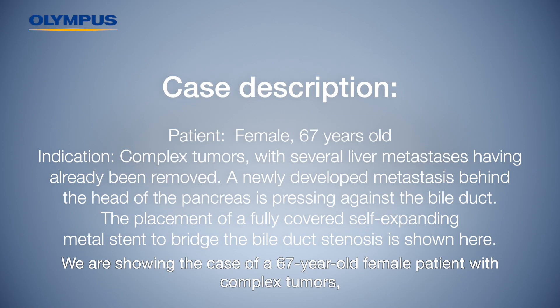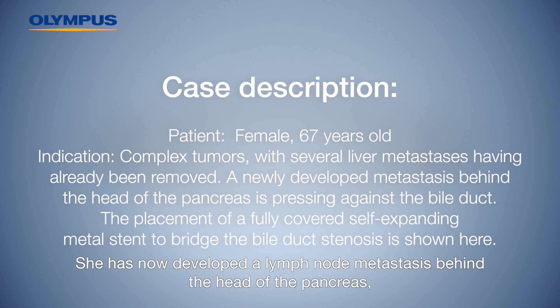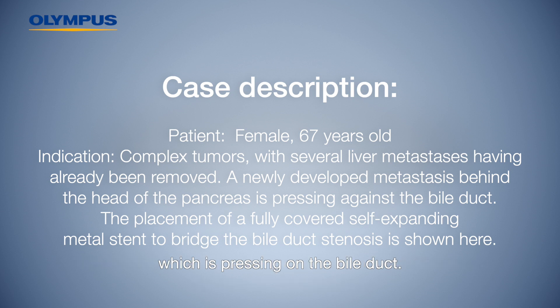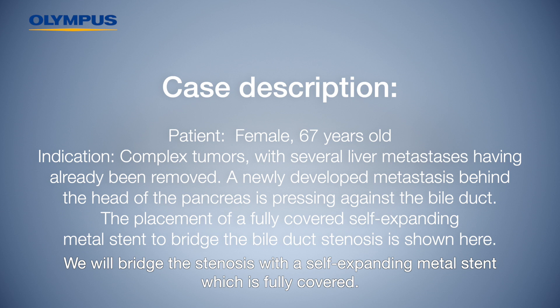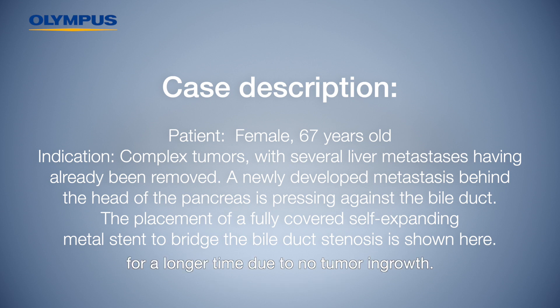We are showing the case of a 67-year-old female patient with complex tumours for whom several liver metastases have already been removed. She has now developed a lymph node metastasis behind the head of the pancreas, which is pressing on the bile duct. We will bridge the stenosis with a self-expanding metal stent, which is fully covered. The coating ensures that the stent remains open for a longer time due to no tumour ingrowth.